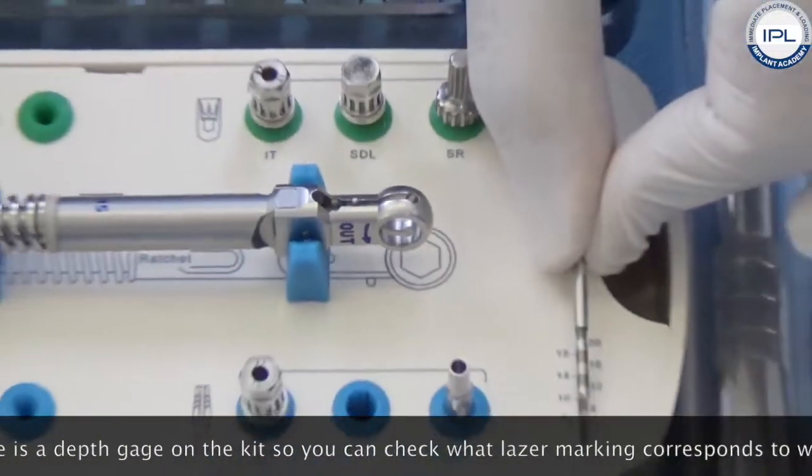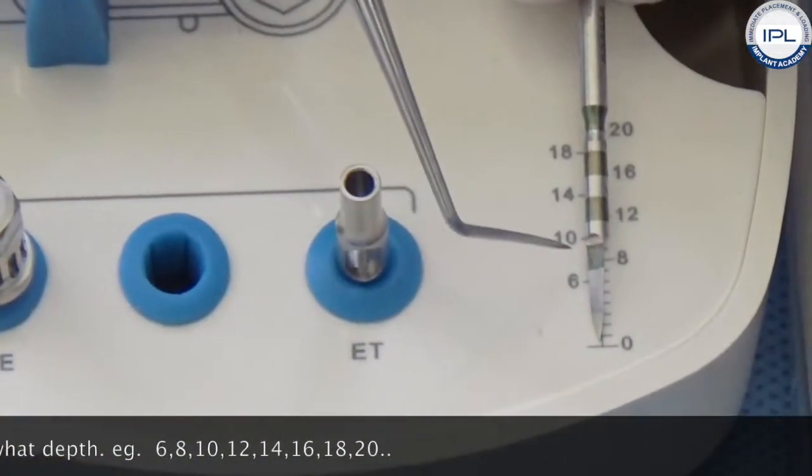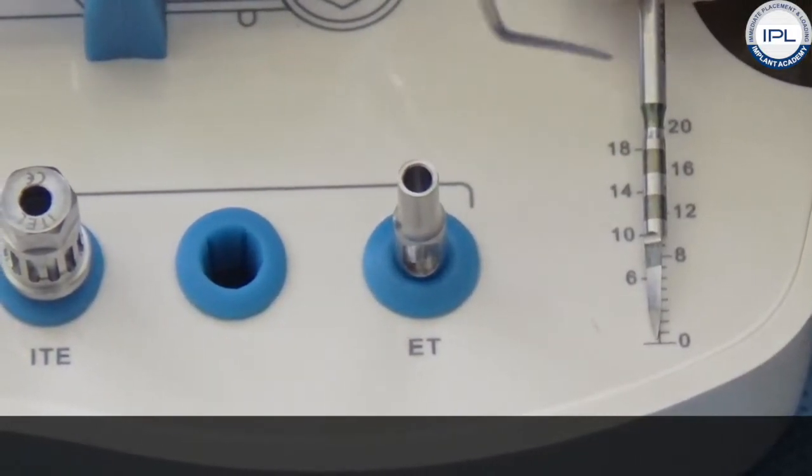There is a depth gauge on the kit so you can check what laser marking corresponds to which depth: 6, 8, 10, 12, 14, 16, 18, 20.